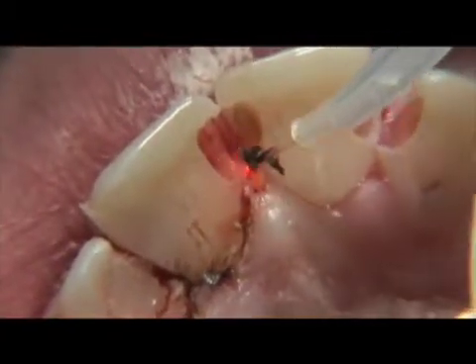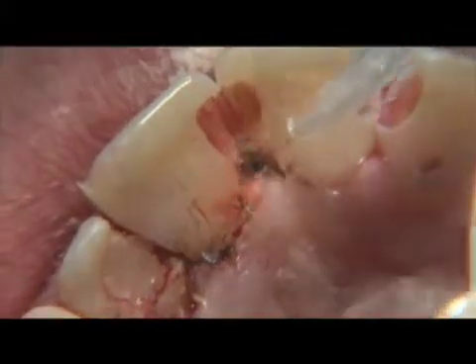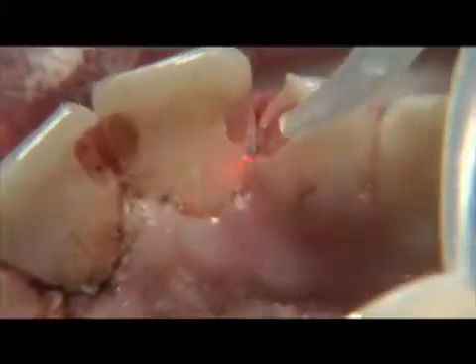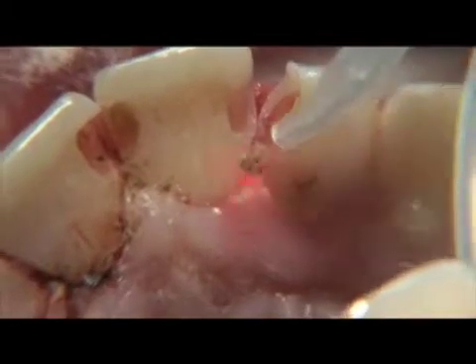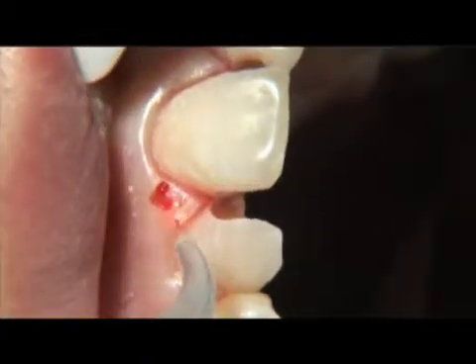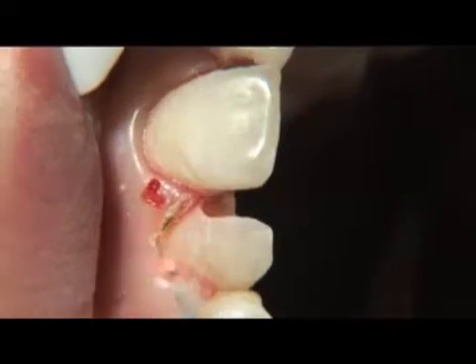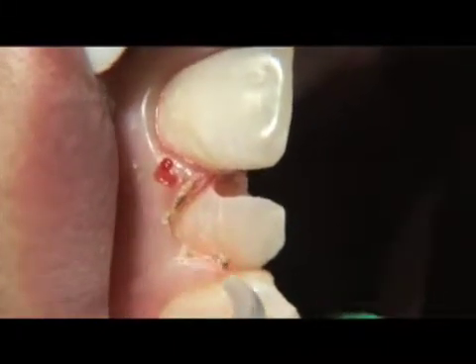This is necessary to create a dry field in order to place the restoration. The central incisors will be restored with composite. The lateral incisors will be restored with full coverage restorations. The laterals are in lingual version, so we will be performing crown lengthening at the same time. This will be done in order to create a more harmonious smile line.